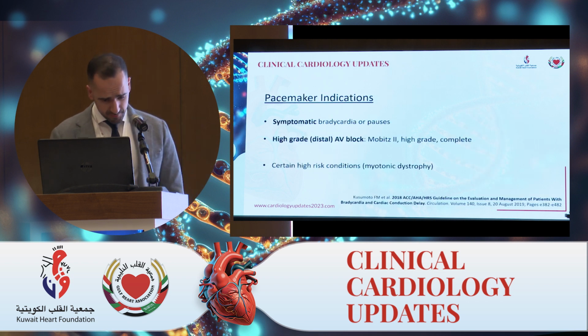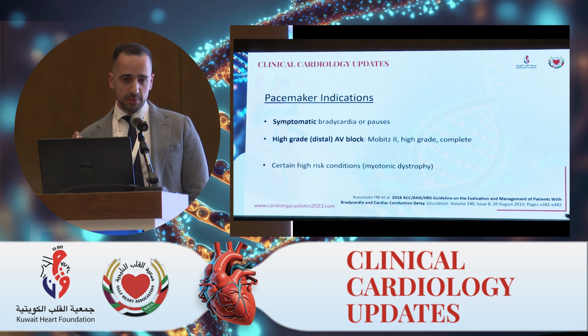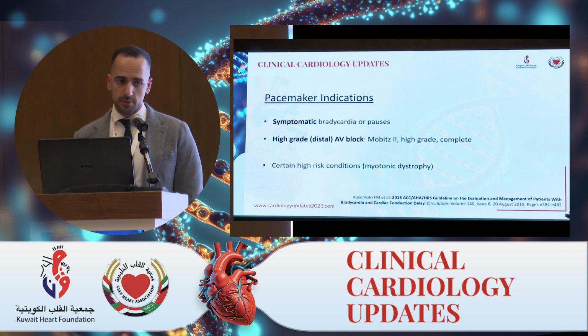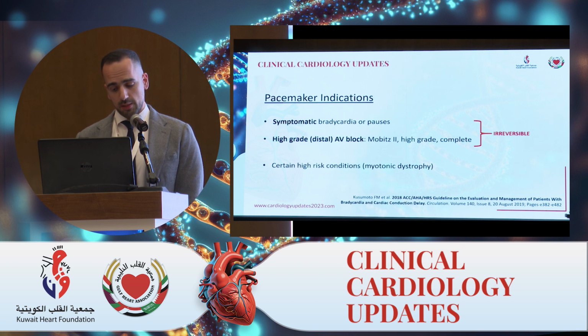Indications. Not to bore you, I'd like to just jump into the main indications. I would highly recommend reviewing the guidelines because there's plenty of indications, they're very well written. But by far and most, the 2 most common reasons that we implant pacemakers are symptomatic bradycardia or pauses and the presence of high-grade or distal atrioventricular block, which is characterized on surface ECG as Mobitz 2, high-grade or complete heart block. It's very important to make sure that these are not due to reversible etiologies before committing your patient to a permanent device.